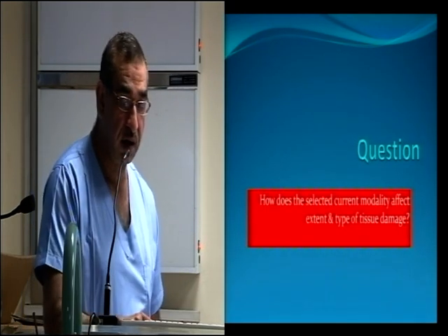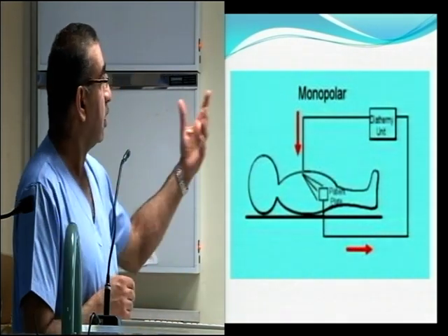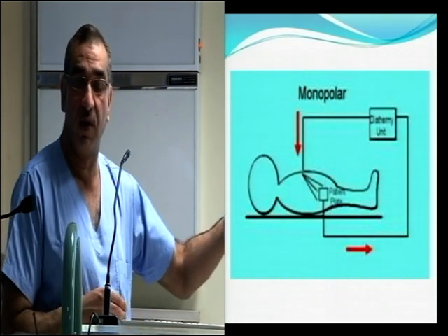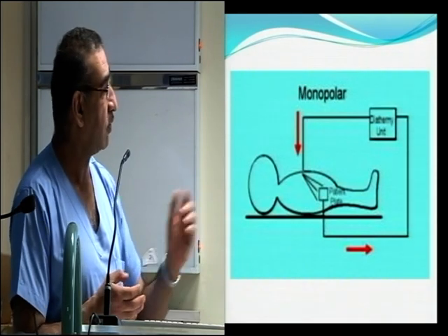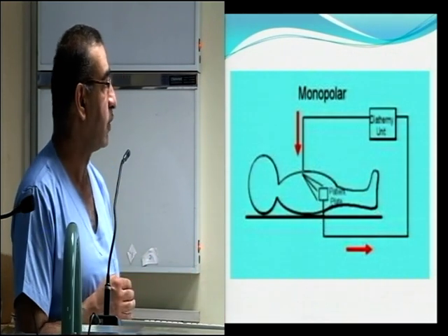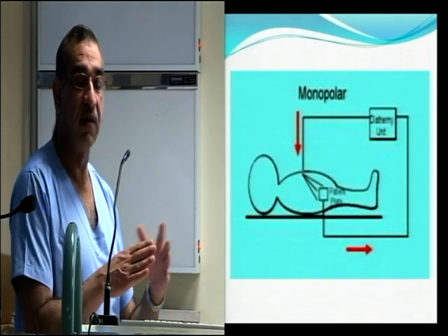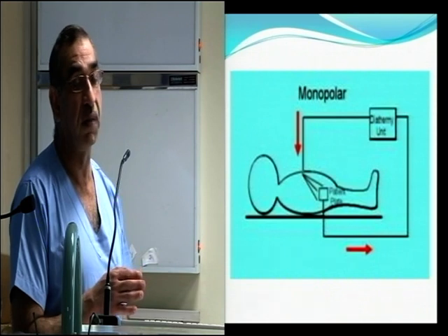First of all, we'll see what sort of diathermy we do. The common one that we normally use for snare polypectomy and sphincterotomy is the monopolar type, in which you attach a plate to the patient, which is quite broad-based, and as it is broad-based, there is less resistance, so it doesn't heat up, and that's important.